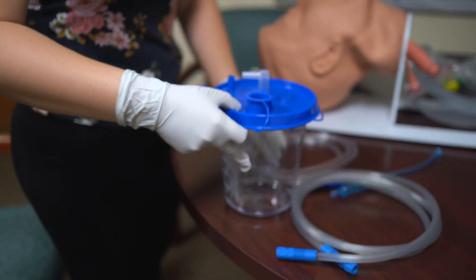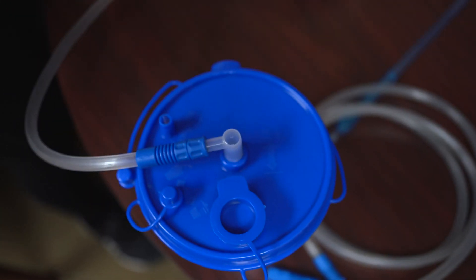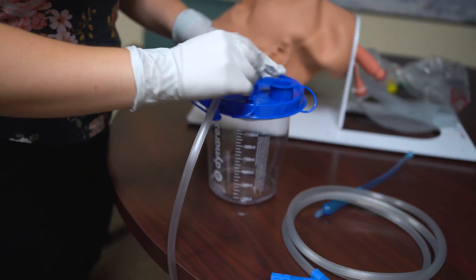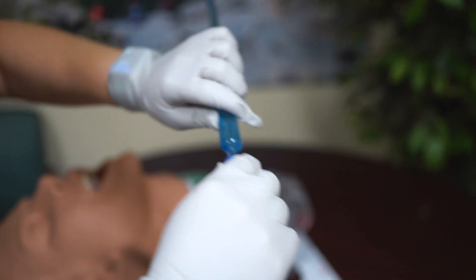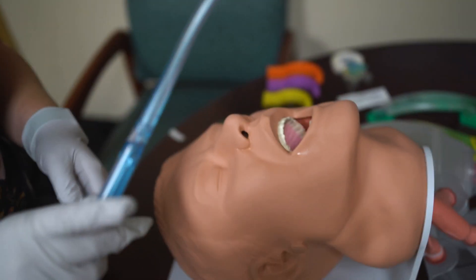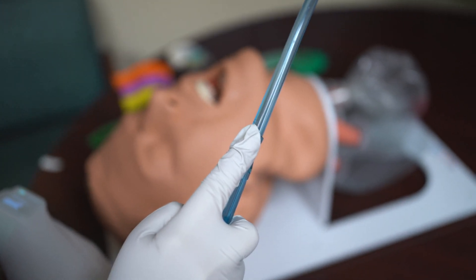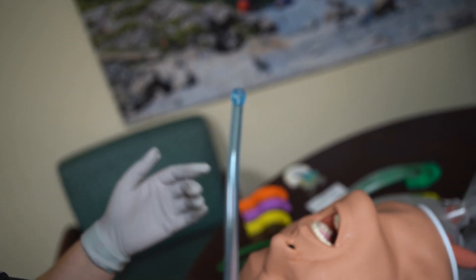I'm going to take the canister and one of the tubes and connect it — this one goes to the vacuum, so it would connect to the physical electronic vacuum if we had one, or the manual. The second tubing goes where it says 'patient,' and the other end of that goes to the yankauer. I'm going to ensure all other holes are covered, because if any are open I won't have proper pressure to make a vacuum. Then I'll turn the device on and check it on my glove — if my finger is covering this hole, suction is in process. I test it on my gloved hand and feel suction power.